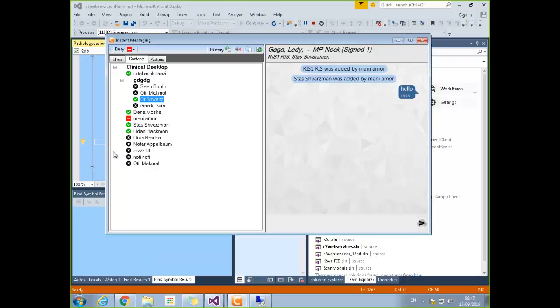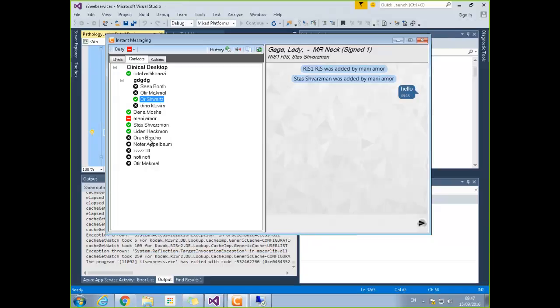No, it's fine. It's just throwing ideas in the air and seeing what's possible. We take it forward because we know we have good infrastructure. We do have a future idea about RIS groups at least. So user groups within RIS, being able to broadcast to RIS groups, or possibly even adding a RIS group, kind of like a mail group inside Notes that is automatically added based on the group that you belong to. So you could have that group automatically added as a reference without adding everyone. Yeah.